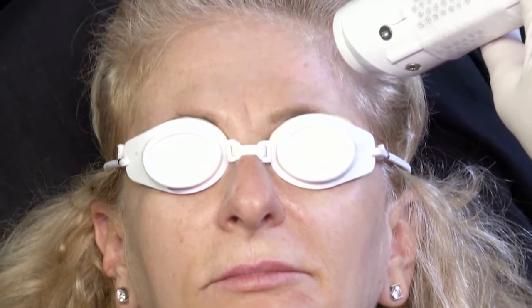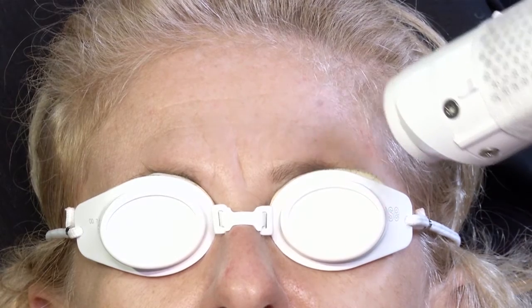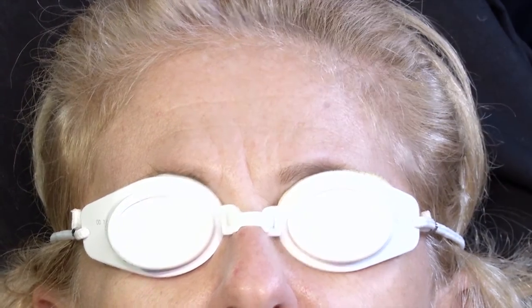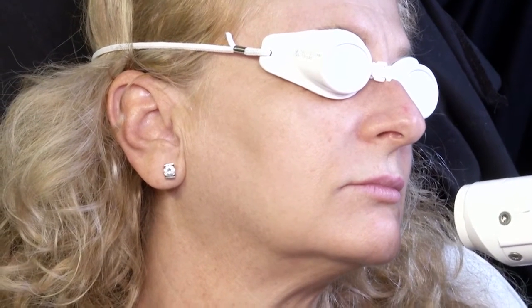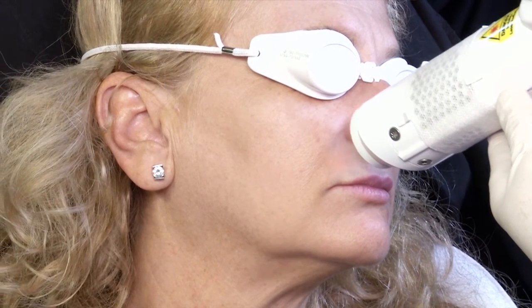How are you doing? Good. See how it's such a simple, easy treatment with so many different, diverse modalities of treatment available with it. She doesn't have — we talk about the one-third, two-third upper lip to lower lip ratio. Her upper lip is a little bit involuted, and this will actually give her a little bit of a lift as well as improving the quality of her skin.